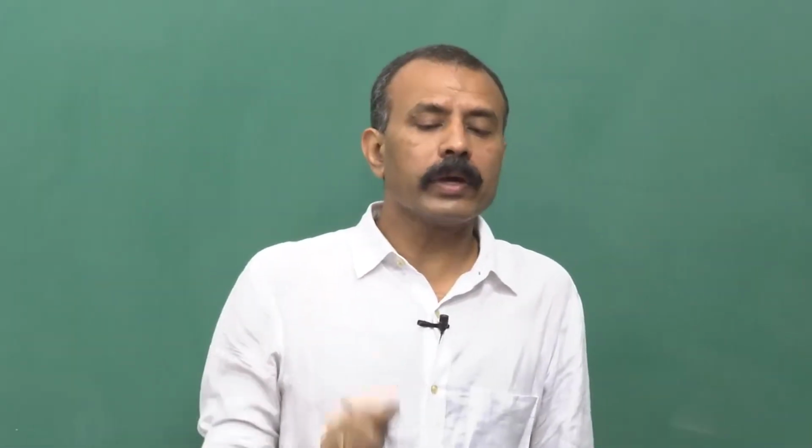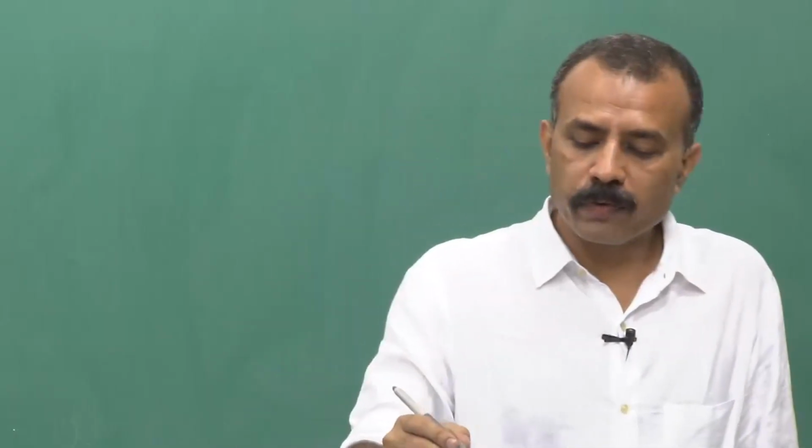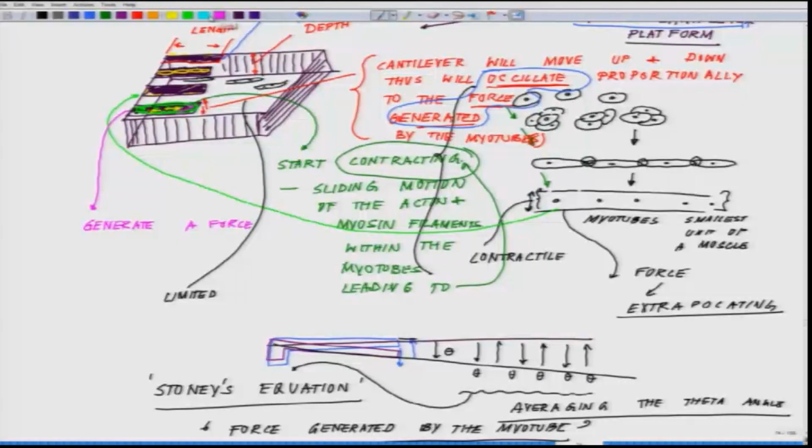The way you can avoid it is, for example, you coat or spray this surface with something which will not allow the growth of cells, some kind of surface coating. While the mask is already there, you first coat it in such a way that nothing ever grows on these walls and not on these surfaces.